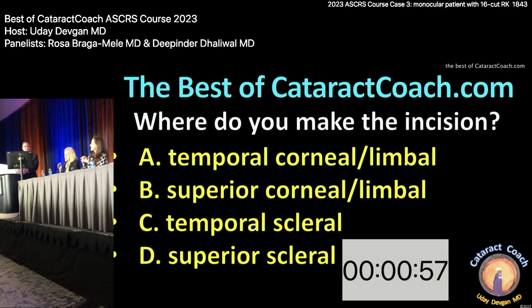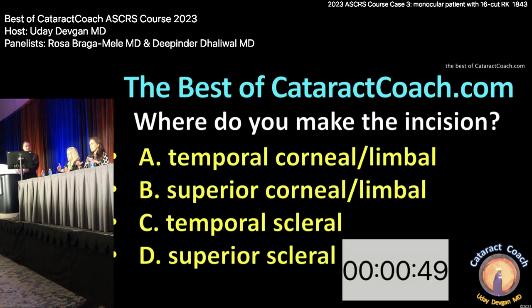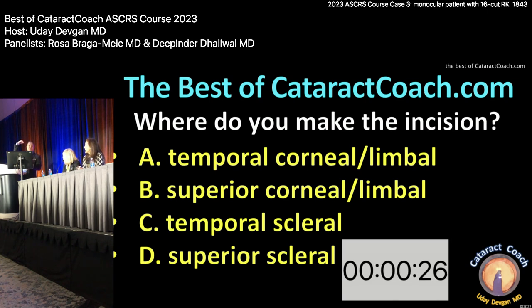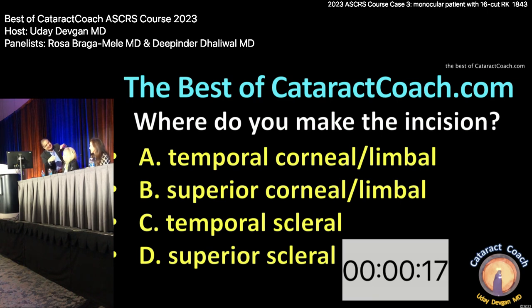Is this the left eye or right eye? Patient's right eye. Right eyes are easy — you just turn your whole body around and you're operating. You could go super-temporal. Super-temporal, right eye here. So in this situation, super-temporal obviously. If you're sitting here, I'd basically do left-handed phaco then. No — why? It's your right hand, you just shift your body. You just turn your chair around and turn the microscope.